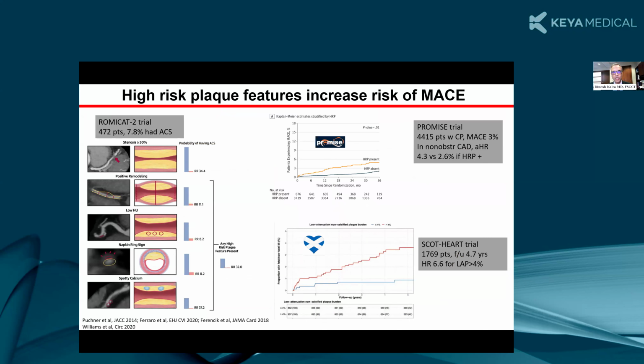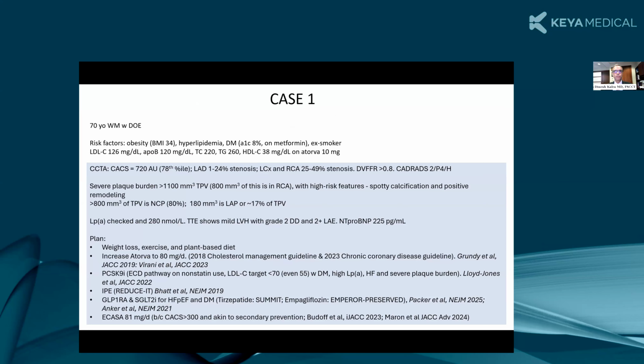And so that information beyond stenosis becomes really crucial in managing your patient. As Dr. Blaha has mentioned, looking at where the plaque is, the diffusivity of plaque and the type of plaque, but more importantly, getting an idea of how much total plaque burden is there can help you not just prognosticate, but then see what you are going to do for therapy.